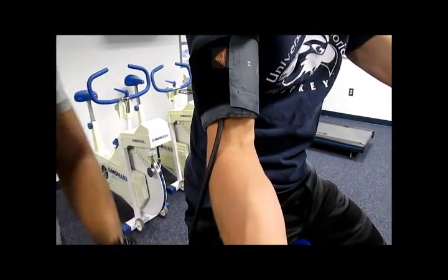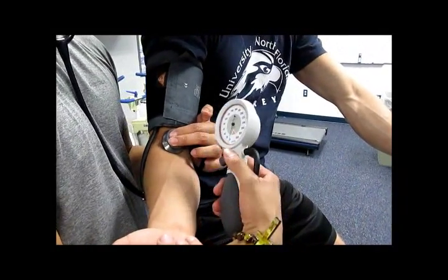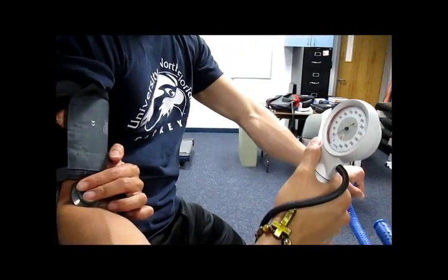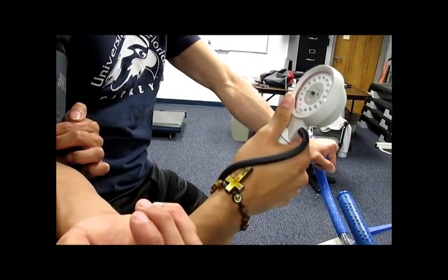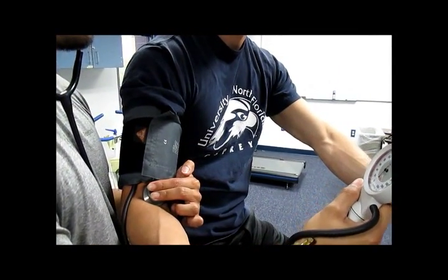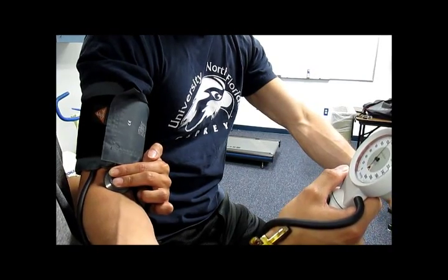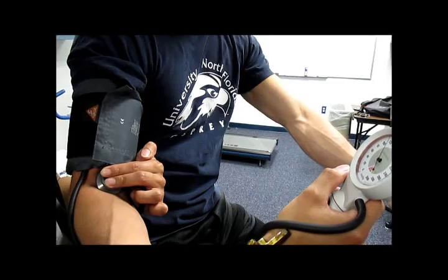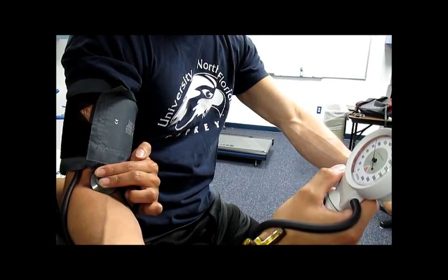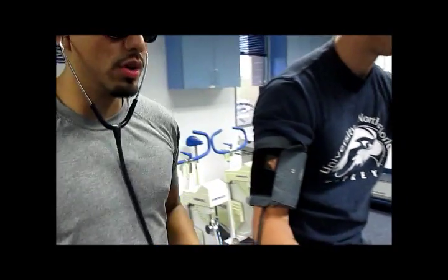Make sure that line matches up with his brachial artery. Take the stethoscope, make sure the ear pieces are facing you and put them in. You can hear that — if you can't hear anything else, you're solid. Put two fingers inside his antecubital space, then pump it up until 160-180 of the participant's blood pressure. Slowly release the nozzle — the first sound you hear is his systolic blood pressure, and the last sound you hear will be his diastolic blood pressure. Result: 112 over 82 — pretty solid blood pressure.